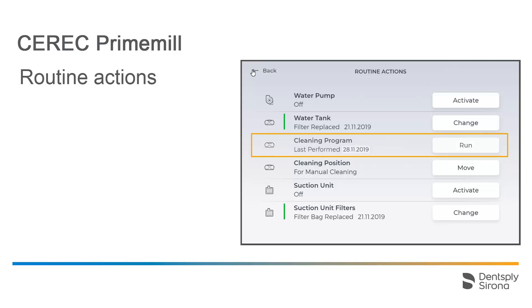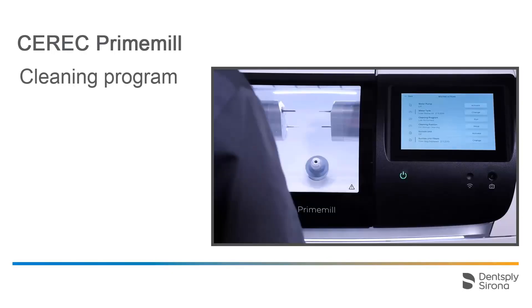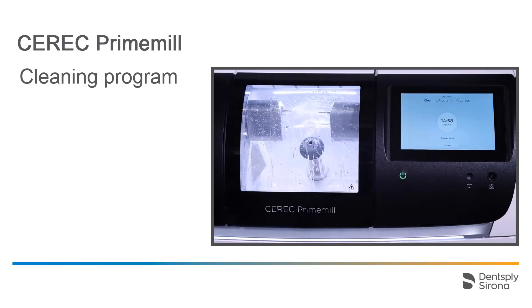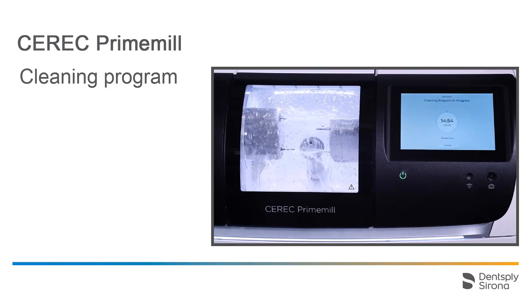The third option here allows you to start a cleaning program. Tapping on the Run button gives you the choice between a 2-minute and a 15-minute cleaning process. The remaining time is displayed in the Touch interface.